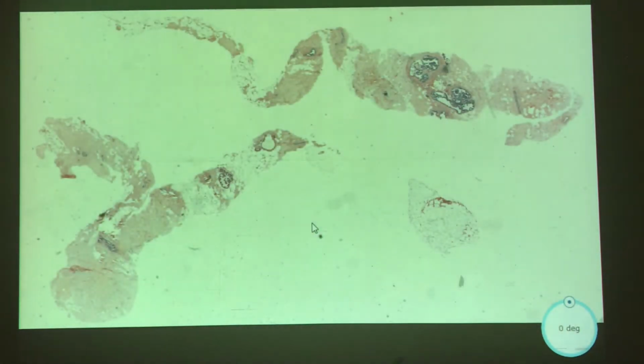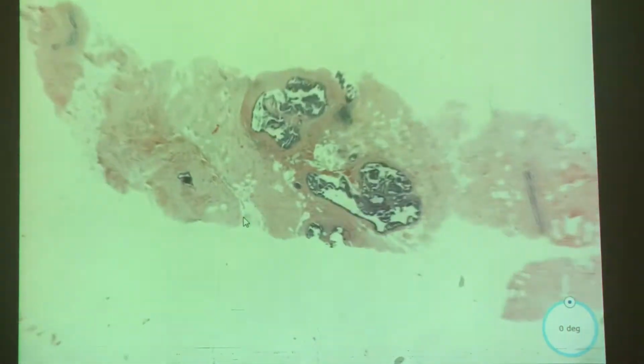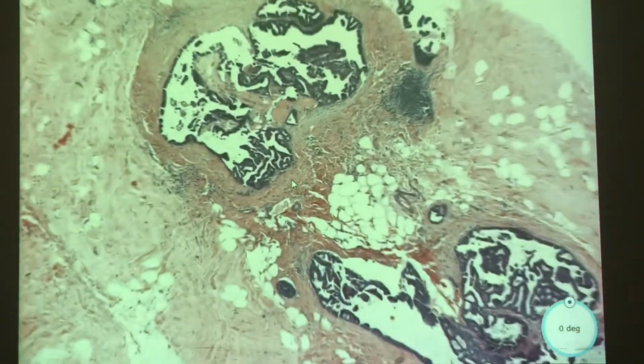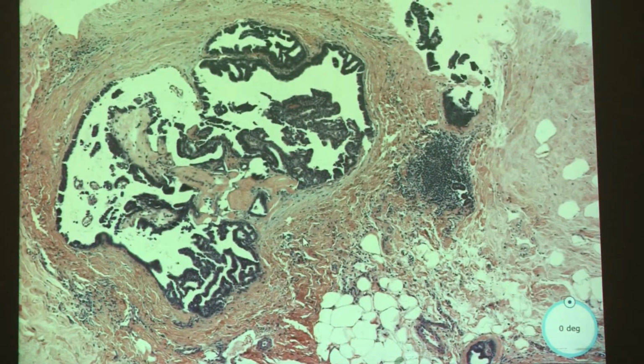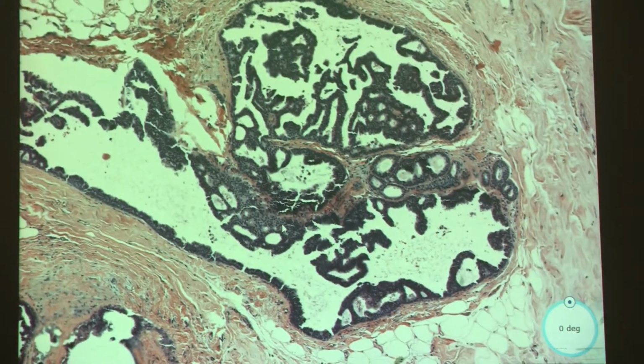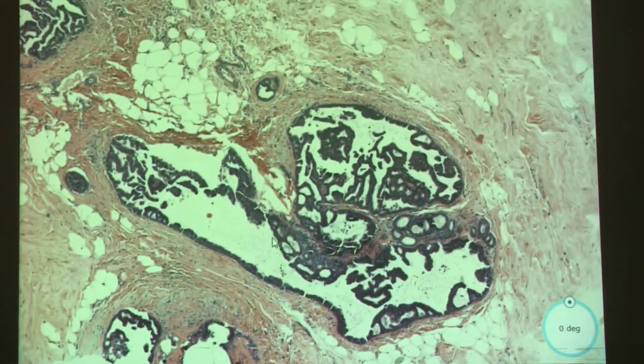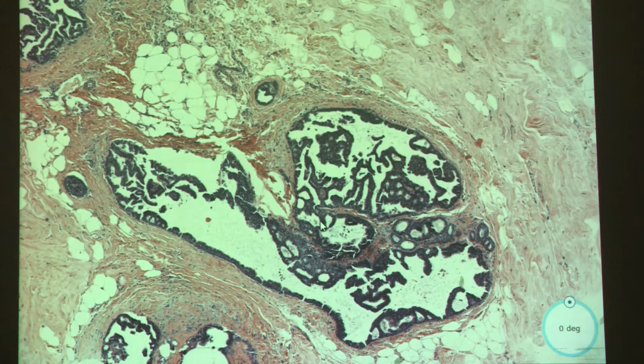All right, more pores, pretty fibrous. There's some ducts here that we're going to focus on for now. So over here, it has a bit like what we were previously seeing, I would say.